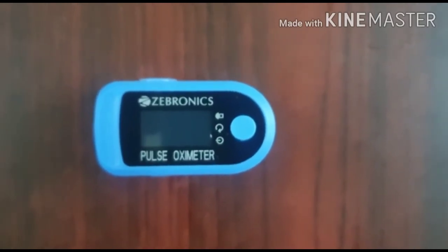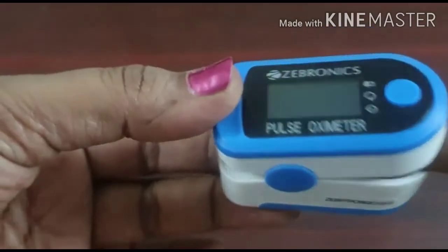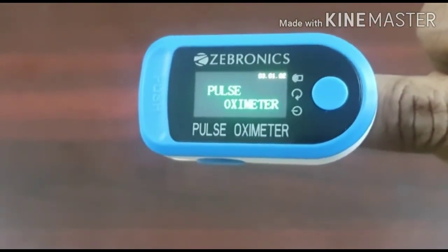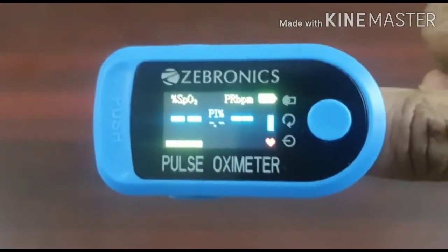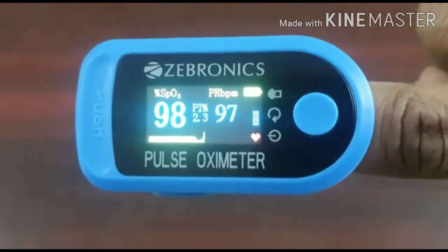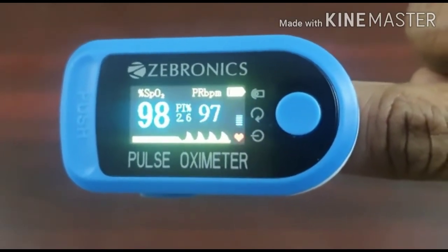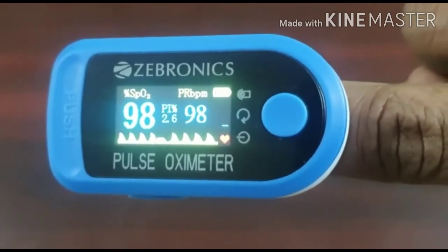To use this, you have to unclamp it like this and insert your finger. The finger you insert should not have nail color on it, and it's better you don't have long nails. You can either insert the forefinger, middle finger, or the ring finger. The first reading displayed here is the oxygen level, and the second number is the pulse rate.